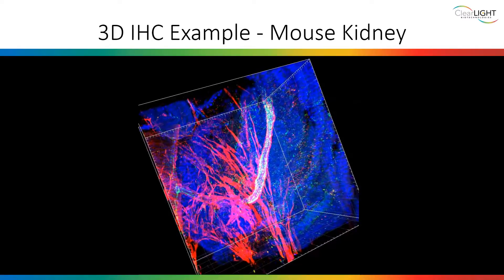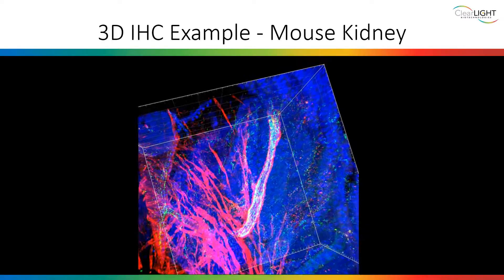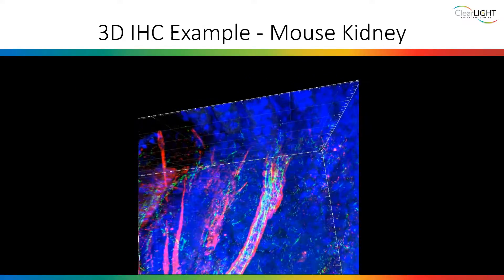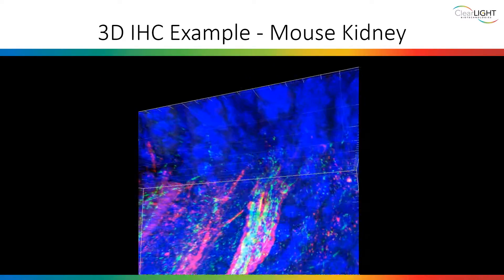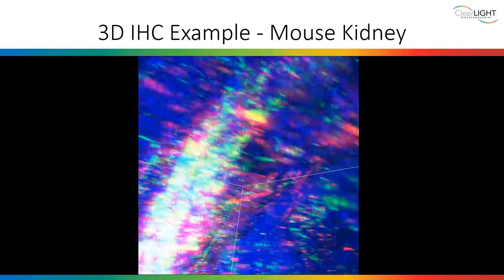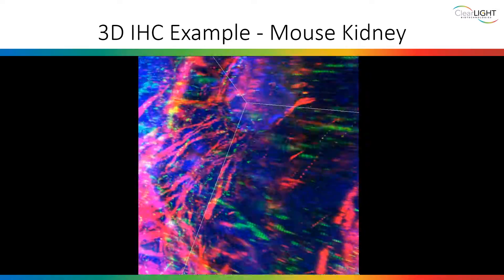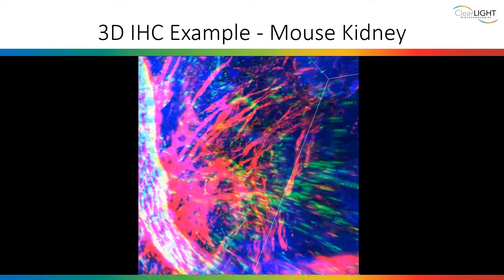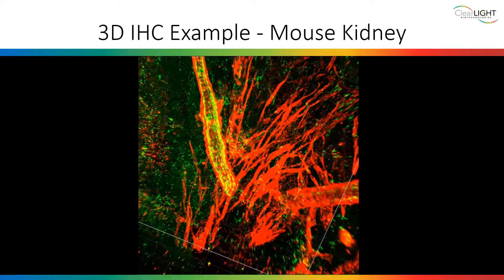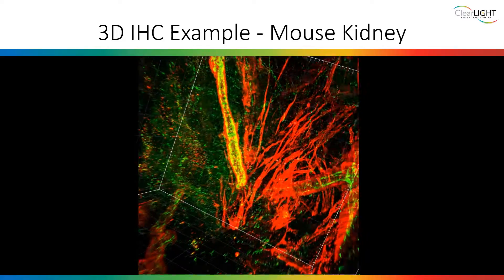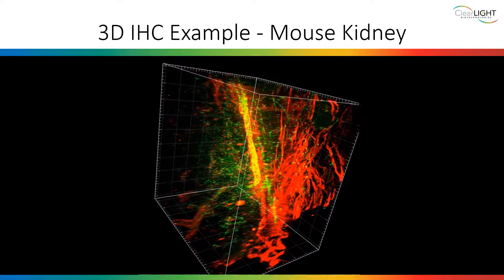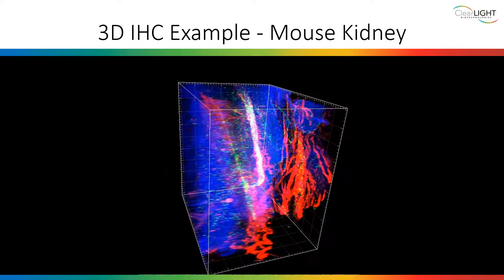As an example, here we look at a mouse kidney immunostained with alpha-smooth muscle actin, seen in red. You can also see CD31, in green, which is used to highlight vascular endothelial cells. And DAPI, shown in blue, is our nuclear counterstain.